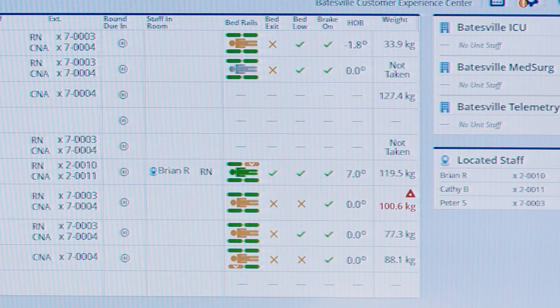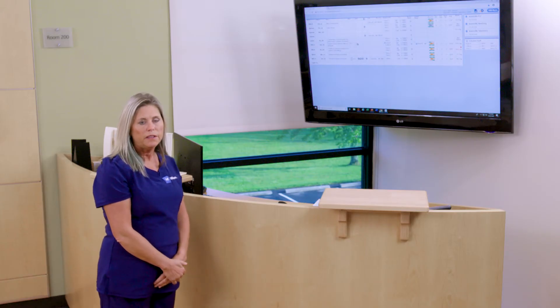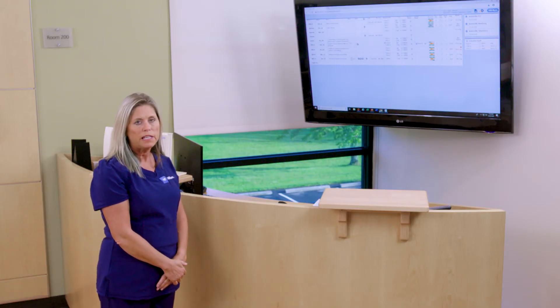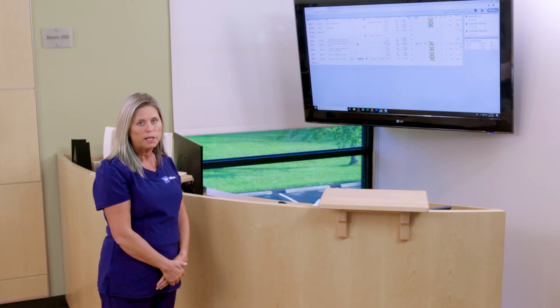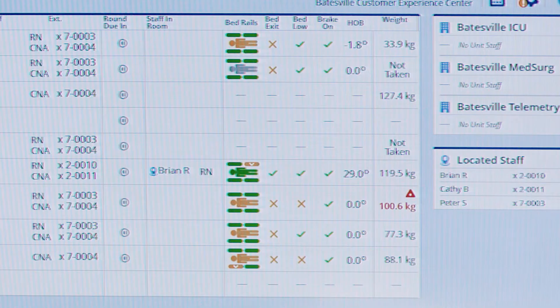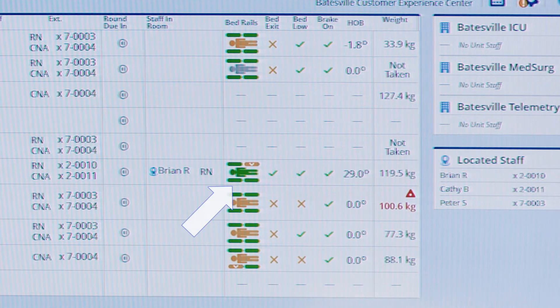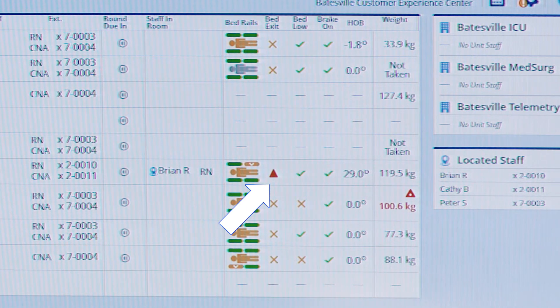In the event that a patient leaves the bed after a bed exit has been armed and the bed exit is alarming, you will see a change in the status on the status board indicating bed exit alarm.